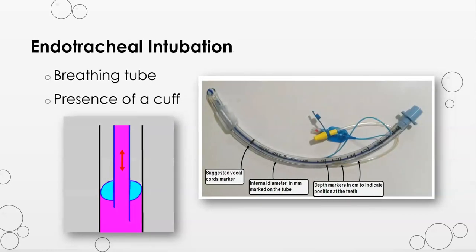Unless the patient has a tracheostomy, an endotracheal tube will need to be inserted for mechanical ventilation, either through the nose or through the mouth. Most commonly, it is placed in the mouth, unless contraindicated. Similar to a Foley catheter, there is a cuff at the end of the tube, which is very beneficial.